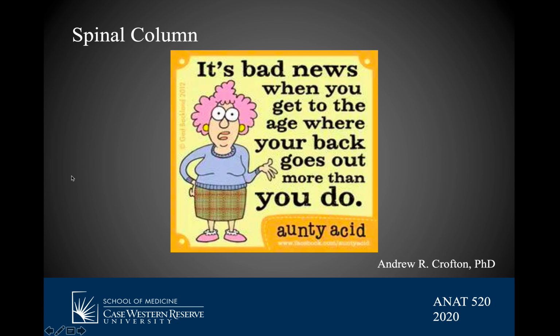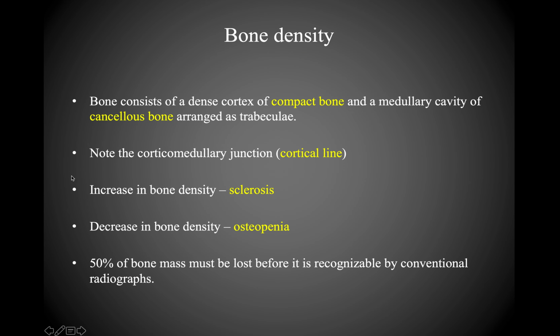Series of videos, we're going to be talking about the spinal column. So to think about the spinal column, you want to keep in mind that we're primarily evaluating bone unless we are looking at an MRI scan. If we are looking at MR imaging, that is the sole indication for looking at soft tissue abnormalities, whereas you might be able to see some degree of soft tissue abnormality or pathology via CT, and to an even lesser degree via X-ray.